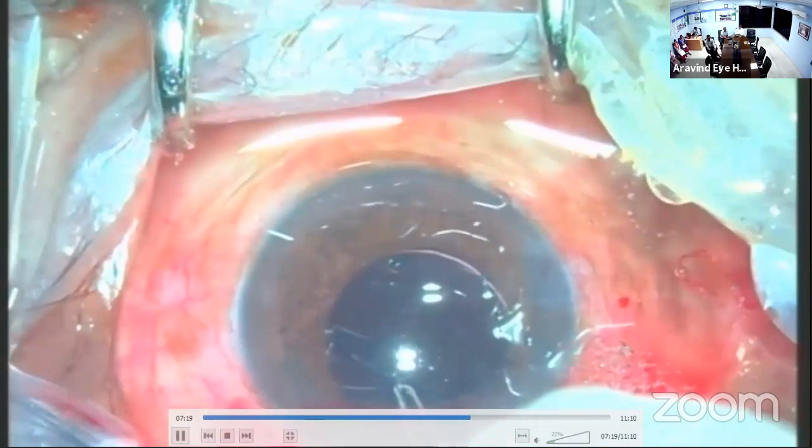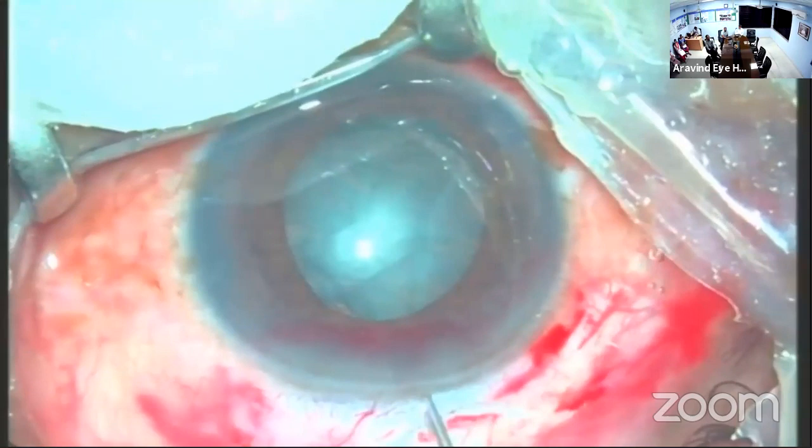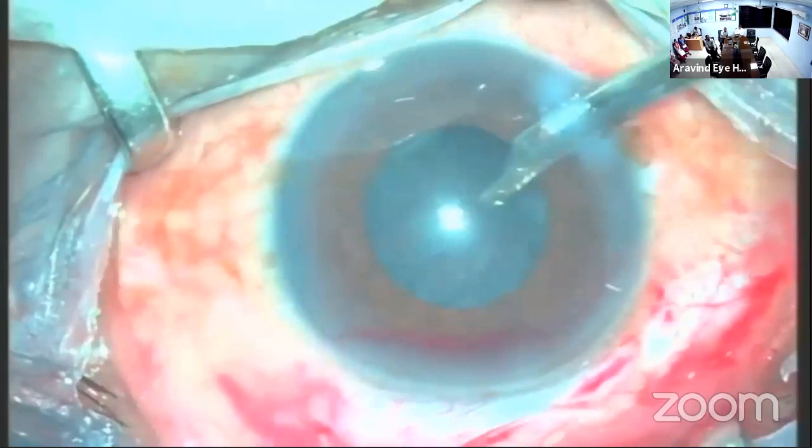If you do a very small capsulotomy, you'll end up having phimosis. So make sure the size is at least 5 to 6 millimeters. The other common problem faced by beginners is retained epinuclear bowl. Like here, you have a soft cataract and a mid-dilated pupil where the rhexis margin is not visible. So when you don't see the rhexis margin, sometimes you end up doing a hydrodelineation instead of hydrodissection. So if you try to aspirate the epinuclear bowl with your Simcoe, it's going to take forever.